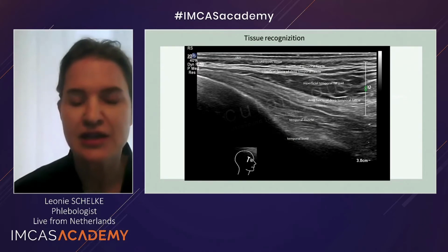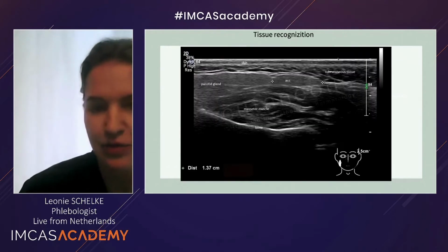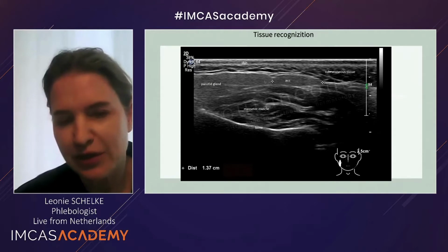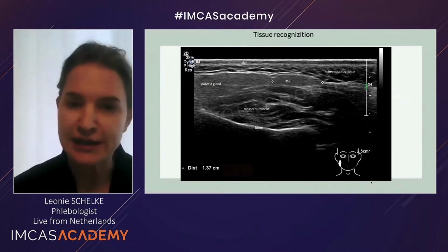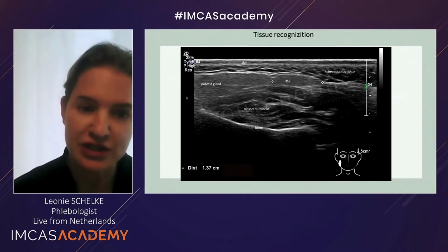Subcutaneous tissue, dermal, more white, and the epidermis. So again, just to help you get a little bit through the anatomy, my probe is positioned here. And this is a little bit difficult because now you have to flip your head around, because the probe is now cranial. So here we're going to the zygoma, and here we are where the masseter and your jawline would be.